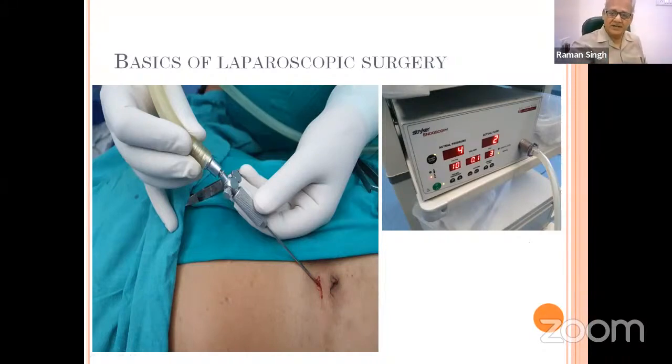Second is nitrous oxide. I have rarely, almost never, seen nitrous oxide used in the abdominal cavity. And third is air. Sometimes the cylinder is empty, and we have no other cylinder. At that time, air is inserted into the abdominal cavity through this pipe, and we finish our laparoscopic surgery. Now, after creating pneumoperitoneum, usually after 1.5 to 2 liters, the abdomen distends.